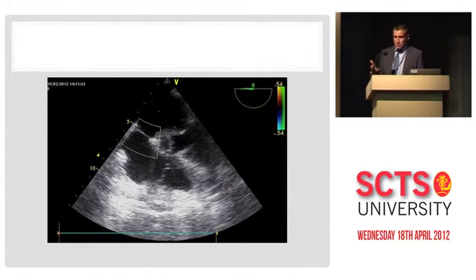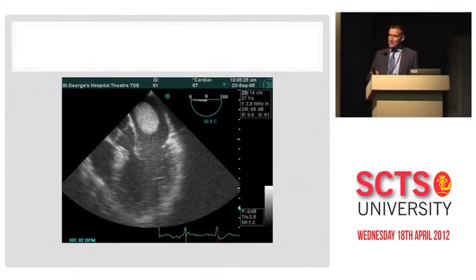This, of course, causes a considerable iatrogenic septal defect. So you can see there in the picture, the surgeon has put a pericardial patch over the intra-atrial septum, and we'll use our colour to determine whether that's been a successful septal repair. If in doubt, one could also potentially use contrast, but that's really more for cardiologists trying to find reasons to put devices in.